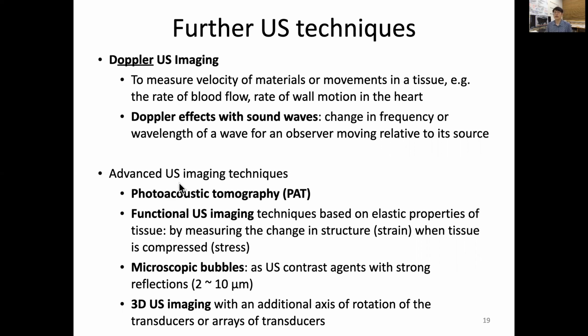So, another, which I'm not going to discuss right now, but very interesting advanced ultrasonic imaging technique, involves, as a first example, photoacoustic tomography. As the name implies, photons generate an acoustic source, and we can image with the ultrasound, so that can create a tomographic image. This is called PAT, which is an emerging technology that allows for more functional imaging by combining the use of photons and detection as ultrasound or sound waves.